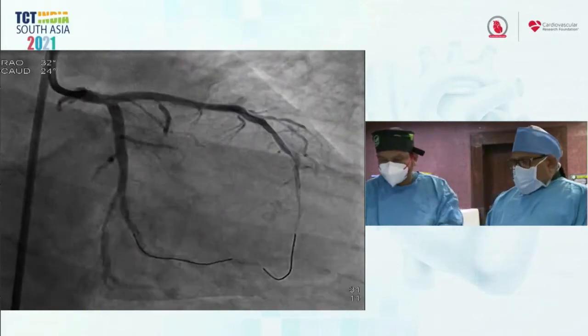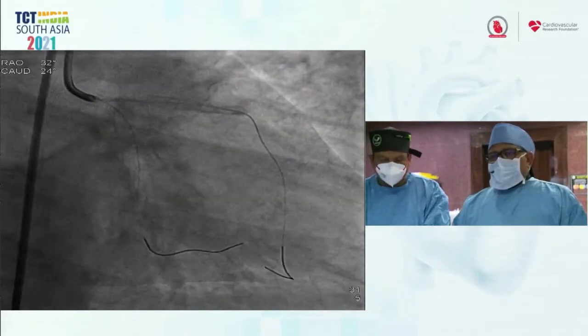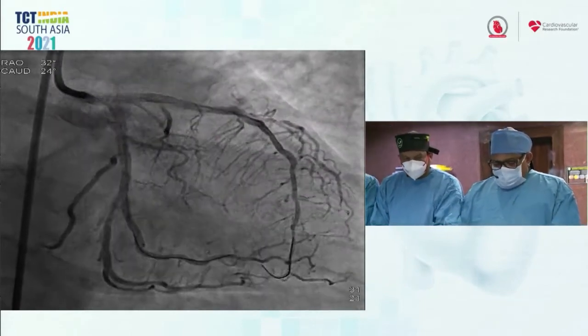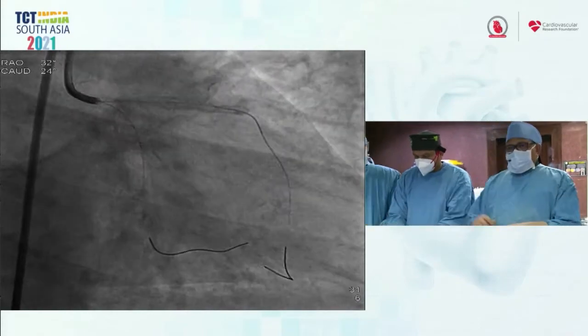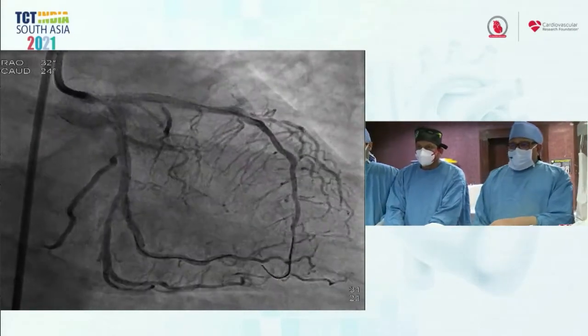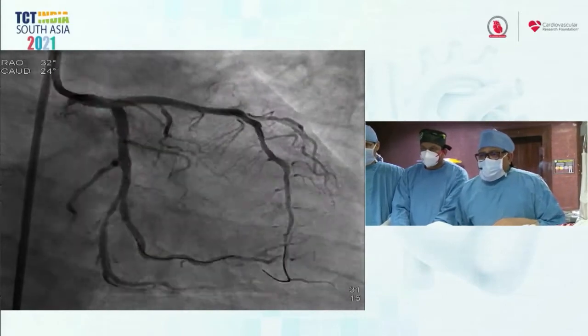The only thing, Rajesh, I didn't see you do is, after the balloon dilatation of the side branch, which is the circumflex, to do a kissing as the last step. Yes. No, I have not done. I am just waiting to go live. To this point, I had done the procedure, and now I am proceeding further.